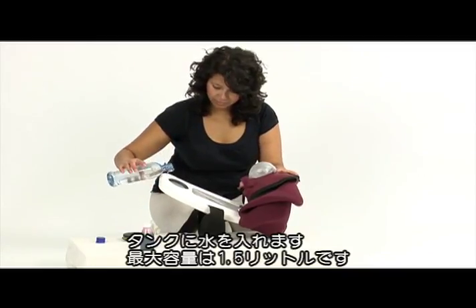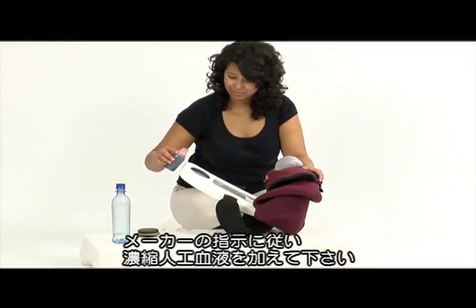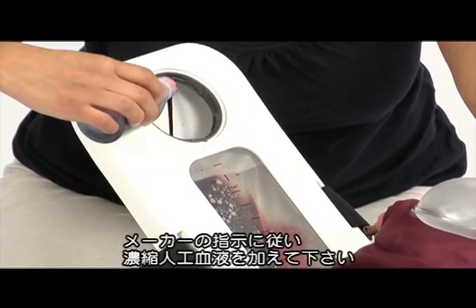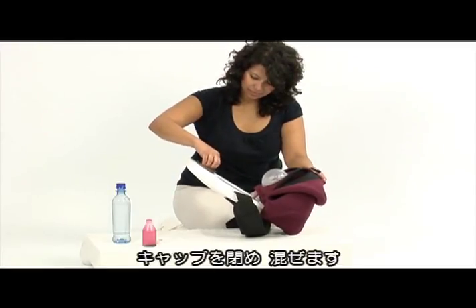Fill the blood tank with the desired amount of water, up to 1.5 liters, and add concentrated artificial blood according to the manufacturer's instructions. Return the blood tank cap and mix well.